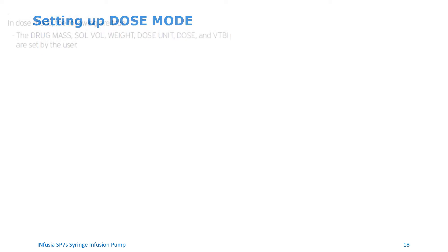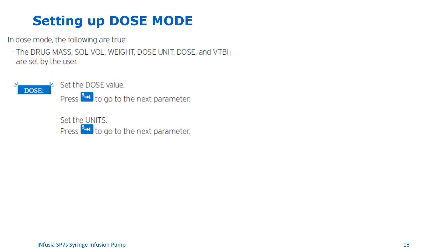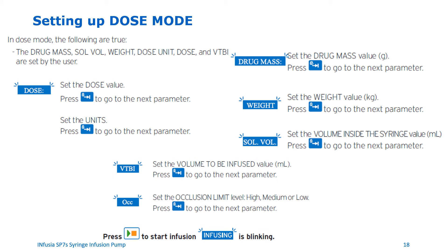Setting up dose mode. In dose mode, you can set up drug mass, solution volume, weight, dose unit, dose, and volume to be infused. To set up dose mode, follow these steps. Set the dose value, then press the switch key to go to the next parameter. Set the units, then press the switch key. Set the drug mass value in grams, then press the switch key. Set the weight value in kilograms, then press the switch key. Set the volume inside the syringe value in mls, then press the switch key. Set the volume to be infused value in mls, then press the switch key. Set the occlusion level to high, medium, or low, then press the switch key. Press the start key to start the infusion. The infusion indicator lights up and the word infusing will start blinking on the screen.